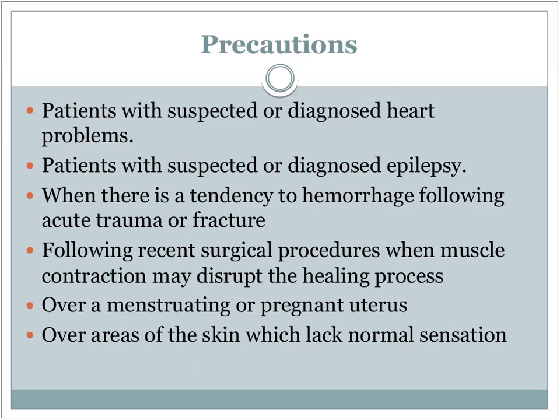Tendency to hemorrhage with trauma or fracture. These are your really delicate people. Or certainly bleeding disorders of any kind. Are you going to create a muscle contraction, microtrauma, and they're going to bleed? Surgical procedures when muscle contraction may disrupt the healing process. I mentioned that earlier. Over a menstruating or pregnant uterus.